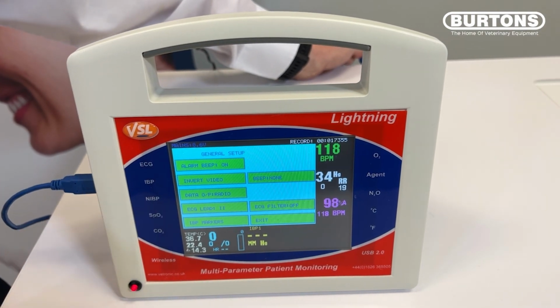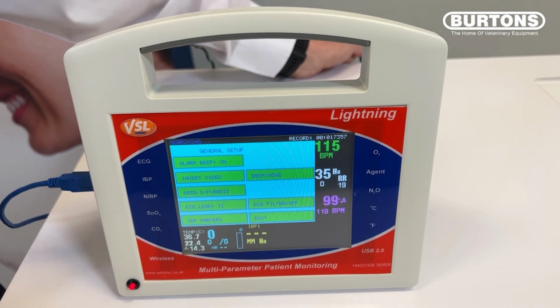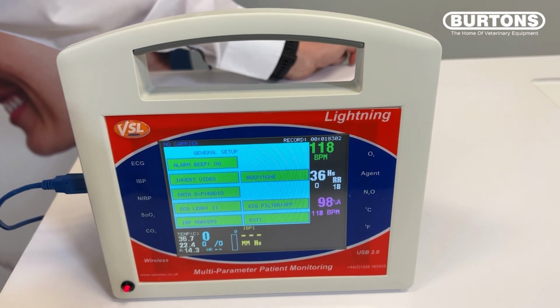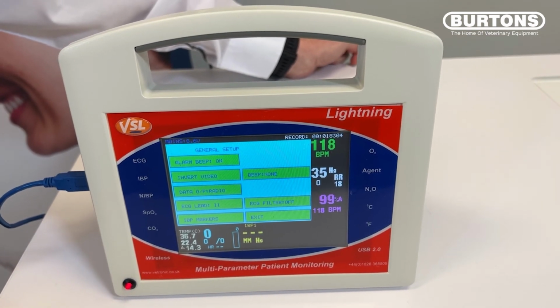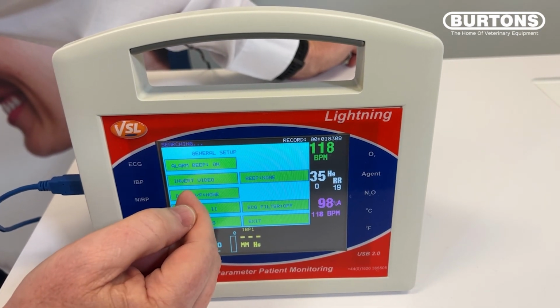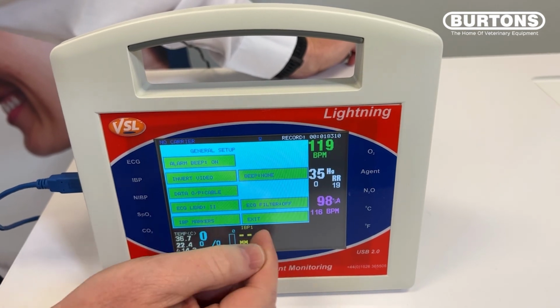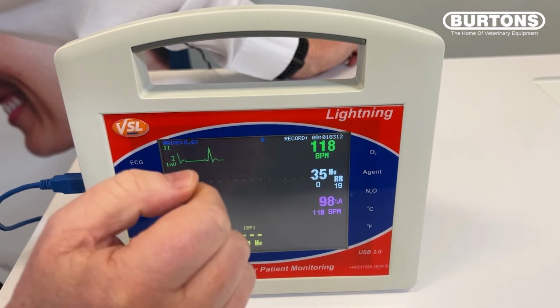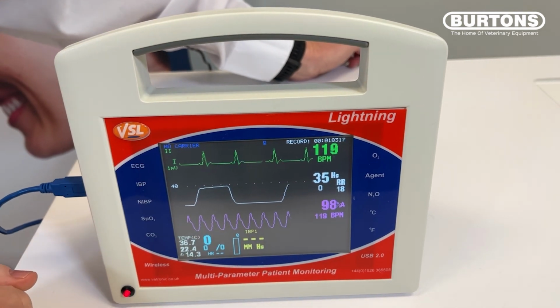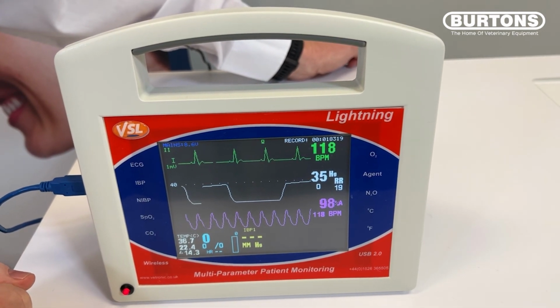That or the wired option sends all the data to the PC where it can be recorded and viewed simultaneously with the data that appears on the Lightning unit itself. Once the data output is set appropriately, we'll put that back to the cable, and simply exit the screen. We have an icon up here now that's flashing to show a little PC to indicate that we've got data being sent to the PC.